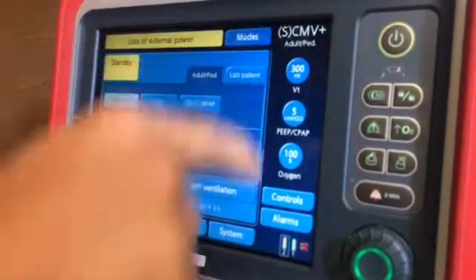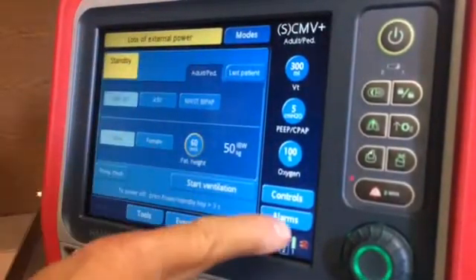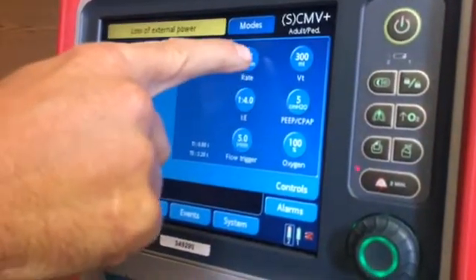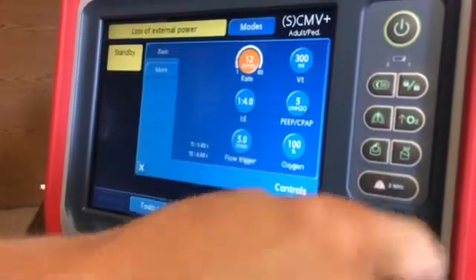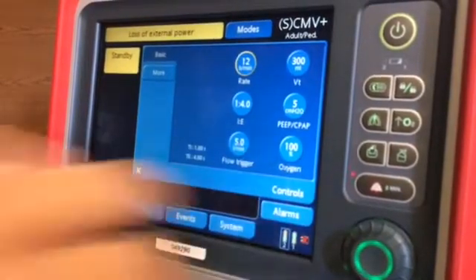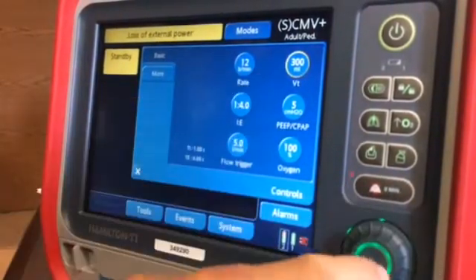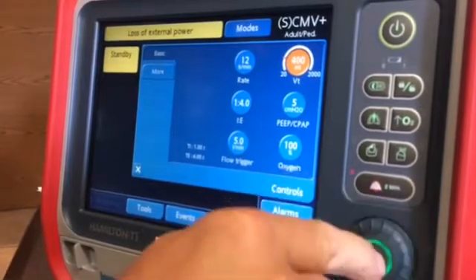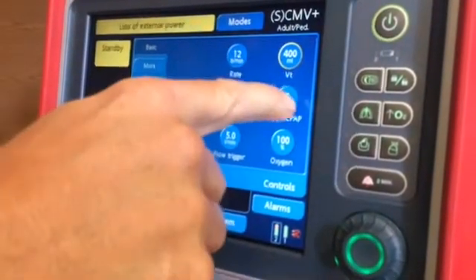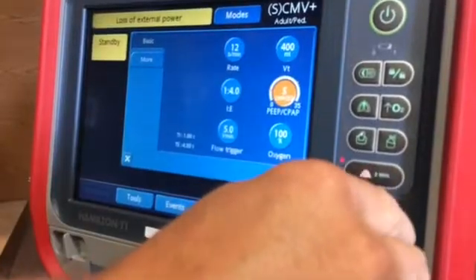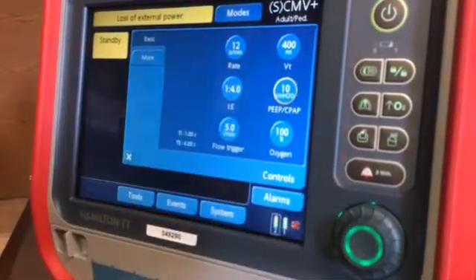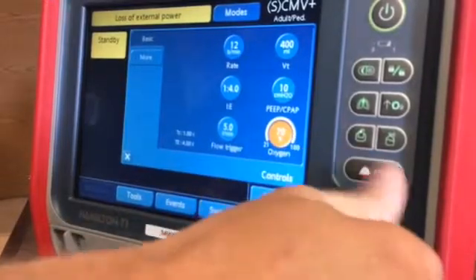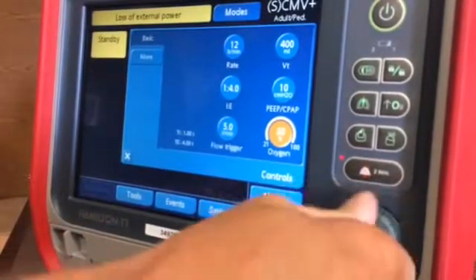If you're going to go with assist control, come down here to Controls. You can choose your rate — push, turn, and confirm. Come over to your tidal volume; if you want to take it back up to 400, push, turn, and confirm. Same way with your PEEP — push, turn, and confirm. And your FiO2 — I'm going to turn that down to 21%, otherwise our vent will constantly alarm.